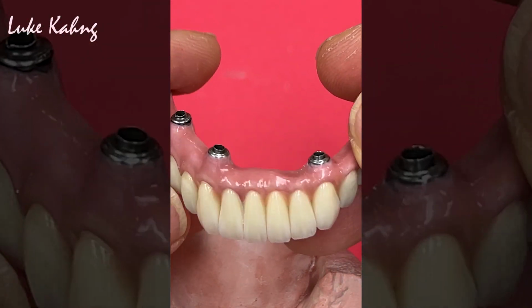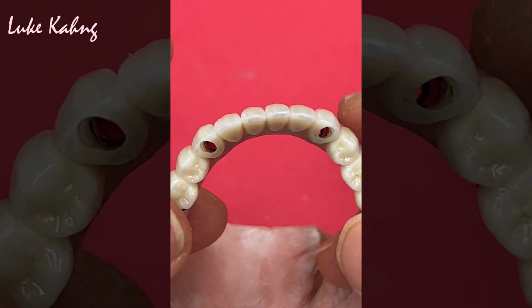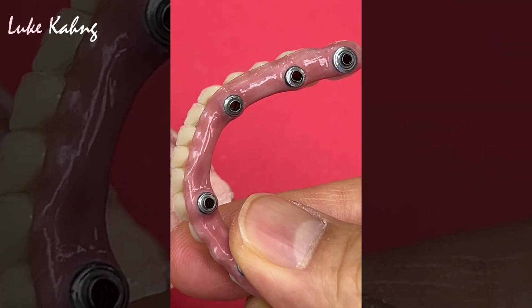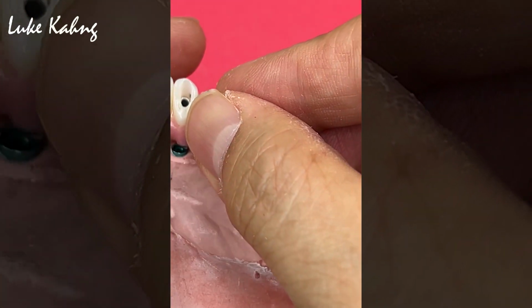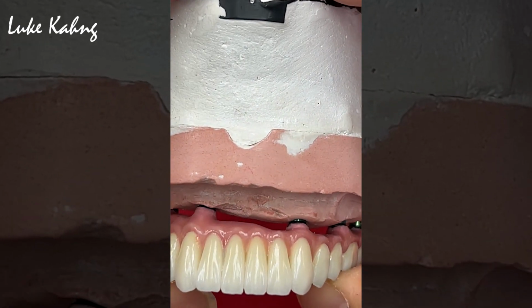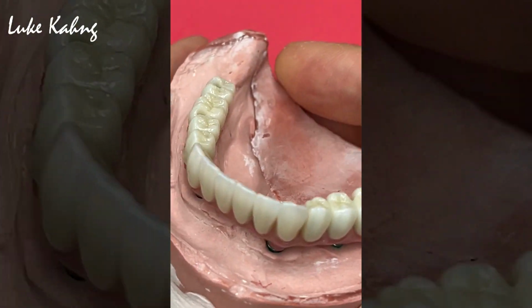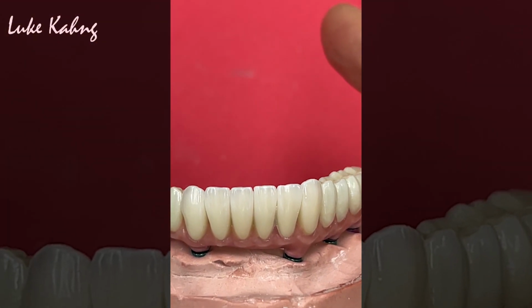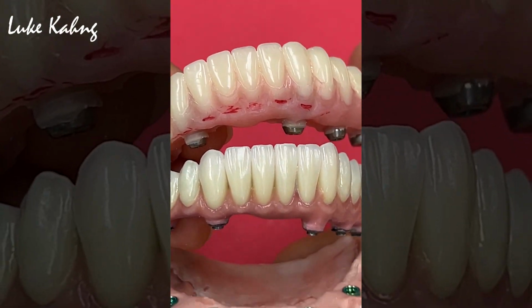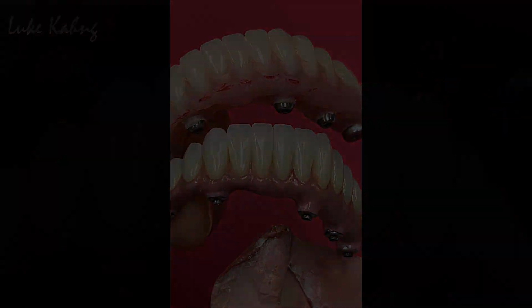We accomplished all our goals. And then some really good hygiene underneath. This is awesome. Okay. This is our provisional. See all the improvements. Alright.